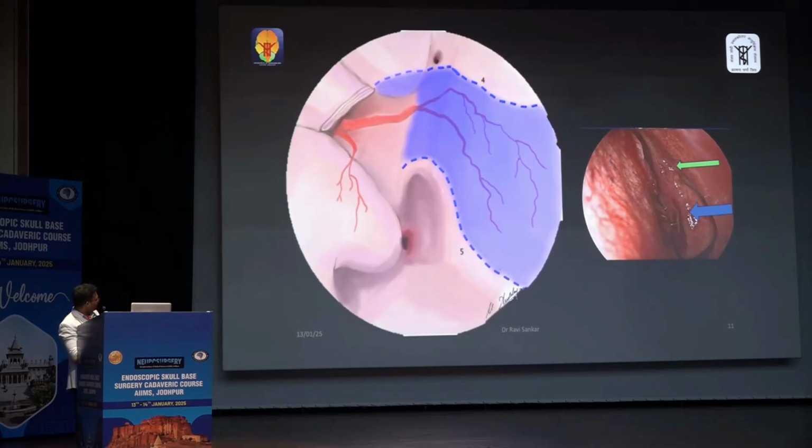So okay, how to make this incision? Whether to go along the posterior septal wall or take the turn depends on the area of the target. Suppose you are dealing with the sella, tuberculum, planum or cribriform, you don't need much thickness here, right? So you can take the angulated cut and make it wider at the anteriormost flap.